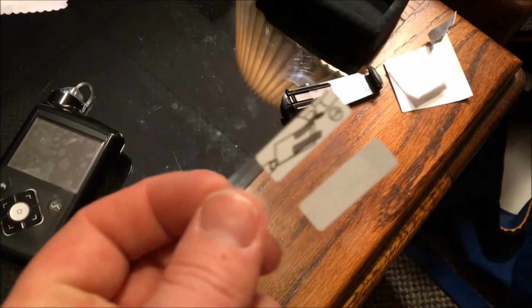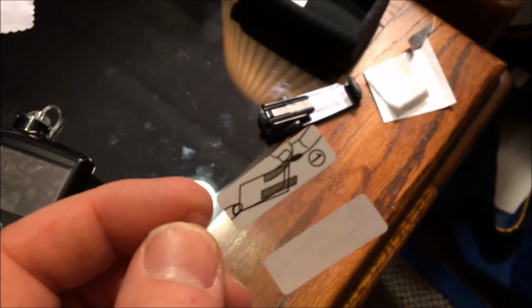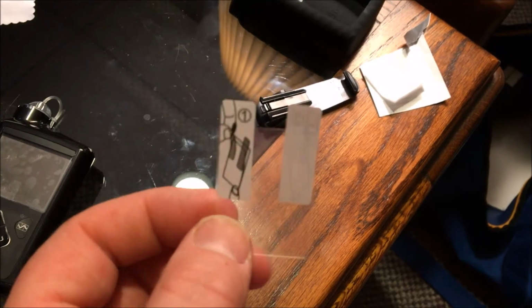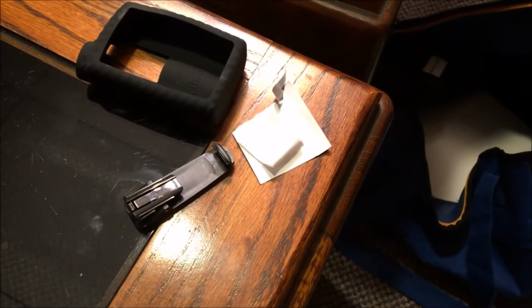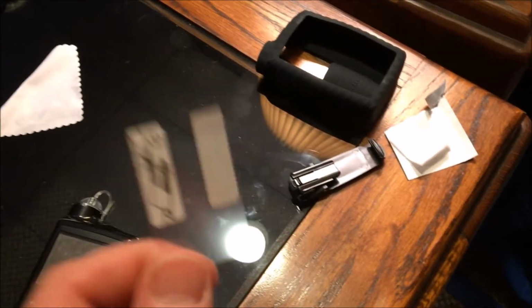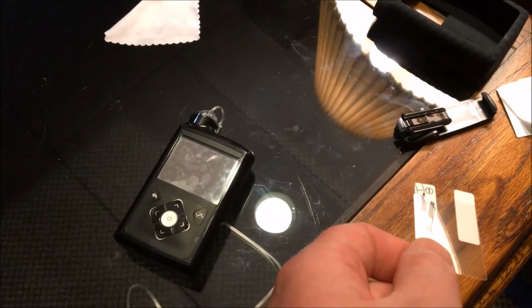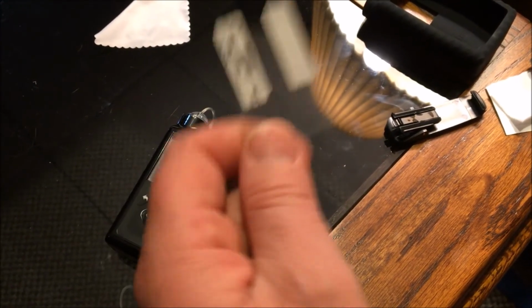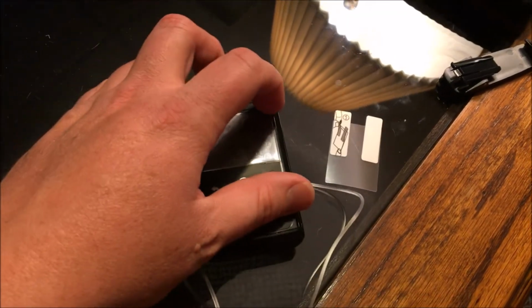Completely new, untouched. So it says it's got a step 1 and a step 2. And essentially what you do is you pull those 2 apart, and there is a lighter sheet of plastic and a heavier sheet of plastic. And I believe it's the heavier sheet that does go on the screen. In there, it also came with that cloth, an alcohol swab, funny enough, and 3 of these. So $7 gets you 3 of these. So I'm gonna take that one off, and we're gonna see about putting this one back on. Since I've used both my thumbs, it should be fun to film, but I'll figure it out. So let's do this. First things first, let's take off this thing.